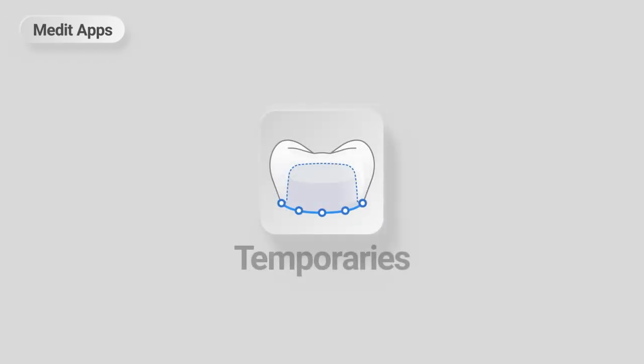This is a quick guide on how to design temporaries using Medit Temporaries app. Let's start with the app installation.